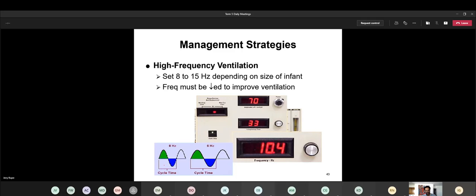And the reason is that here is a picture that shows your amplitude and, how am I trying to make this easier to think about? This is just a situation where you've got your hertz set at 8, which will be 480 cycles per minute, or 480 breaths per minute. Now the green and the blue are representing volume. So volume underneath the curve means volume that is being delivered to the airways.